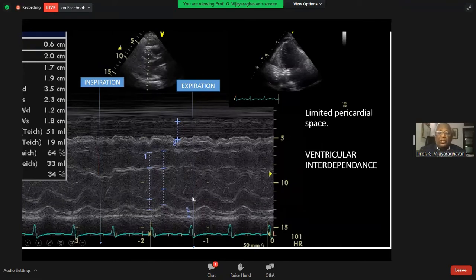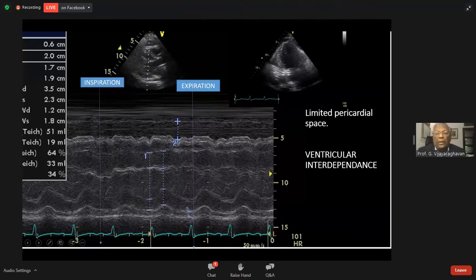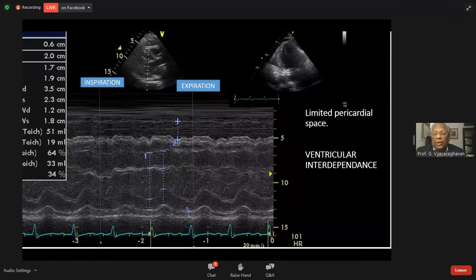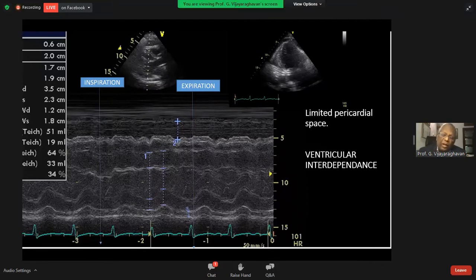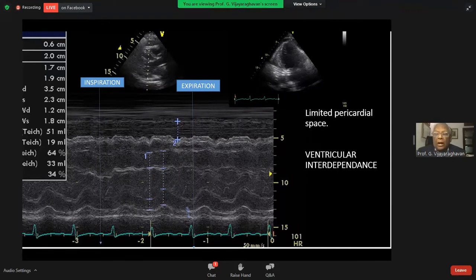These phasic changes of ventricular dimension with respiration are unique to constrictive pericarditis. Depending on this, there will be changes in mitral and tricuspid flow. These variables are not present in restrictive cardiomyopathy.